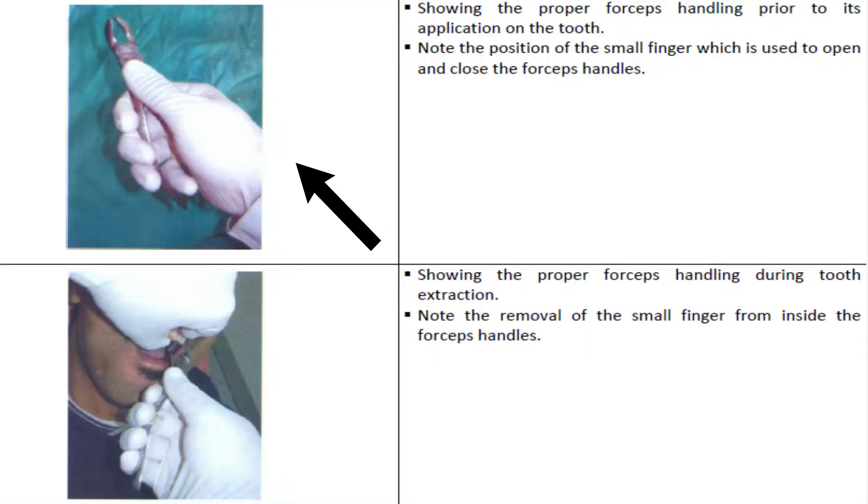This is the proper forceps handling prior to its application on the tooth. Note the position of the small finger, which is used to open and close the forceps handles. During tooth extraction, note the removal of the small finger from inside the forceps handles during action.